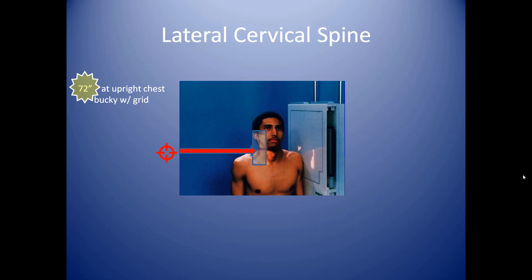The patient should stand with feet slightly apart and their shoulder touching the board — do not let them lean on it, as that will further distort the cervical spine. Have them stand up straight and just touch the board. Open collimators side to side to include the neck with a little room, but not all the way — digital systems produce much cleaner images with closer collimation. A good baseline technique for this examination is 40 mAs at 80 kVp — significantly more than the AP because the camera is pulled back nearly twice as far, greatly increasing the need for more mAs and kVp.